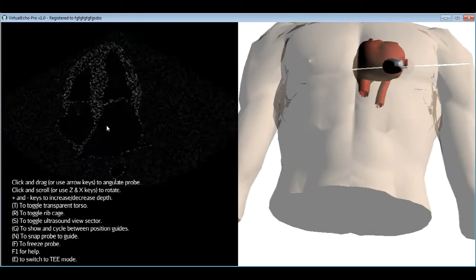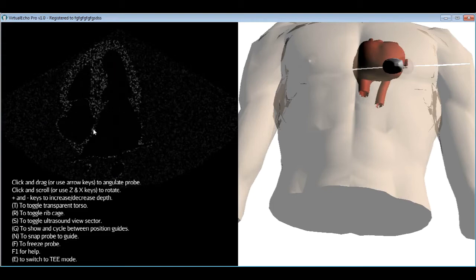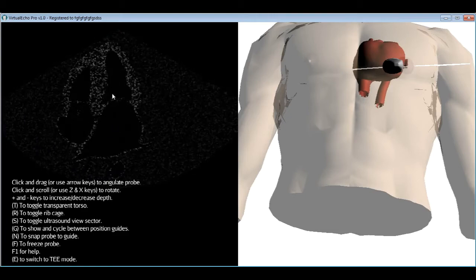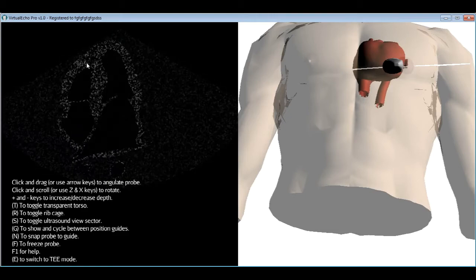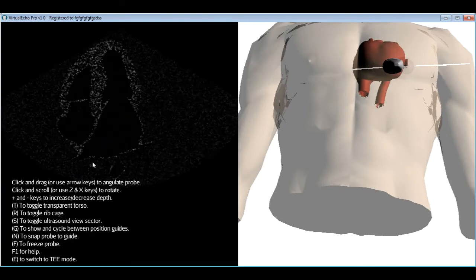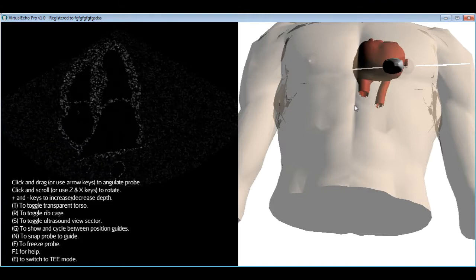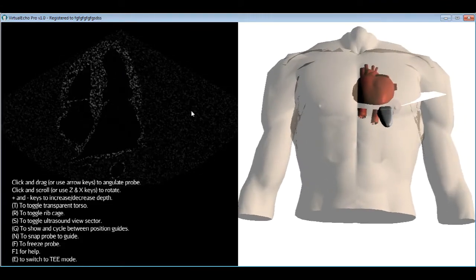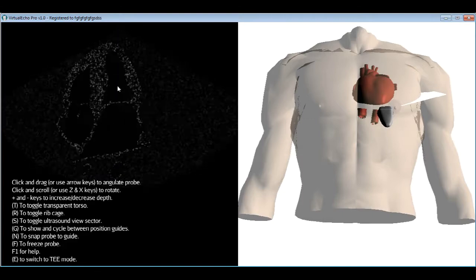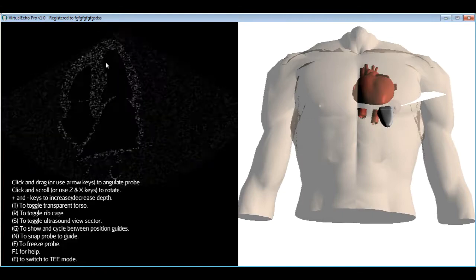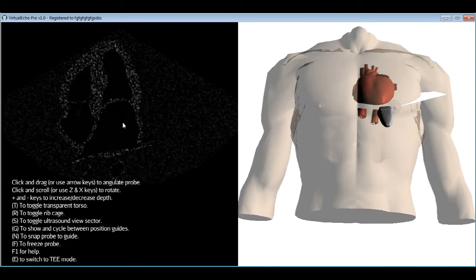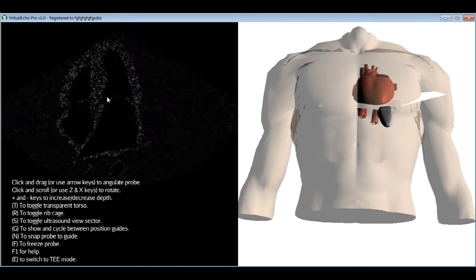In the apical four chamber view, you see two ventricles and two atria side by side: the left atrium and left ventricle with the mitral valve, and the right atrium and right ventricle with the tricuspid valve. Pulmonary veins entering the left atrium are also visible. This is a very useful view for examining mitral and tricuspid valve blood flow using color, pulsed, or continuous wave Doppler, as the blood flow direction aligns with the Doppler wave.